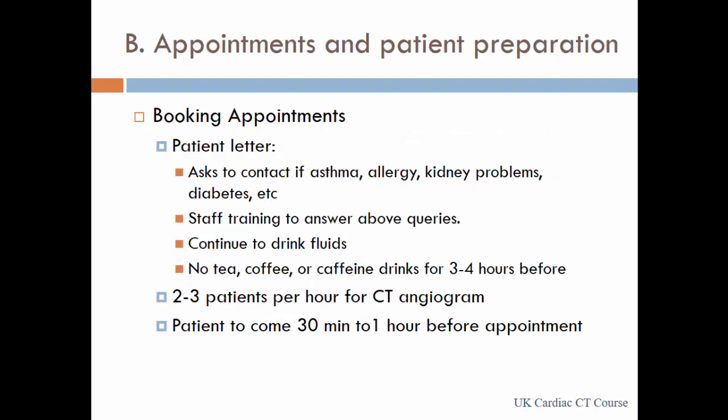Then the second aspect is the appointment letter that goes out to the patient. At that time, the staff will go through all the different contraindications for the procedure. They will be able to answer the queries of the patients, and if they cannot, they will bring the request to us to ask what they should do. In terms of patient preparation, we ask the patients to continue to take oral fluids, but they should not drink any caffeinated drinks. So no tea, coffee, or any other caffeine drinks for at least 3 to 4 hours before the procedure. But they should take their medications as normal.